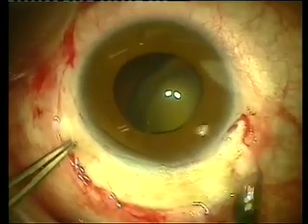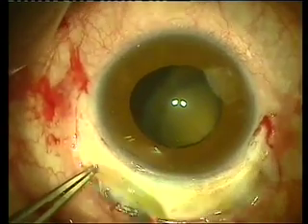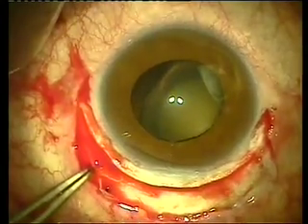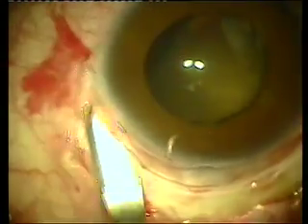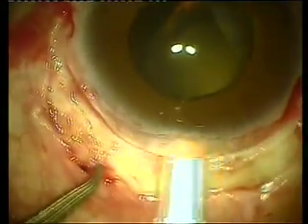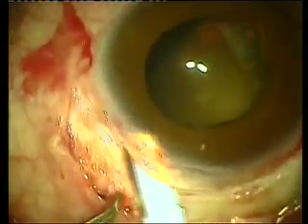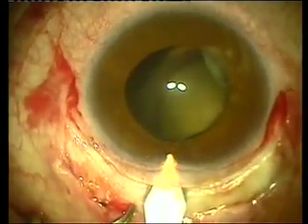We're trying to establish a large corneoscleral lip in order to minimize postoperative astigmatism and maximize the seal that the opposition of the incision will have postoperatively. As you can see here, we're creating a large corneoscleral lip of at least three millimeters with the crescent blade, and now with the keratome entering the anterior chamber.